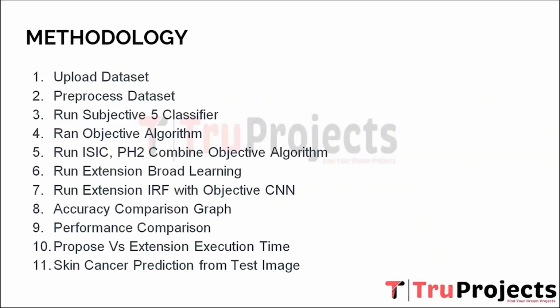Sixth, run extension broad learning. As part of continuous improvement, the system explores extension techniques like broad learning. Broad learning involves a high-capacity learning model capable of capturing complex features, which can further boost the predictive performance of the skin cancer detection system.